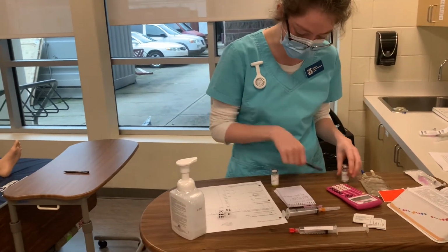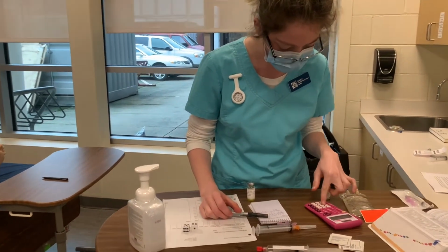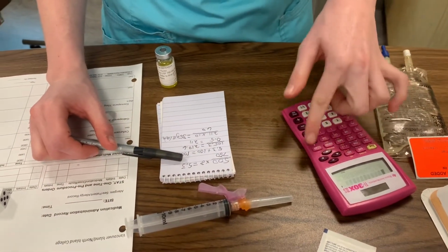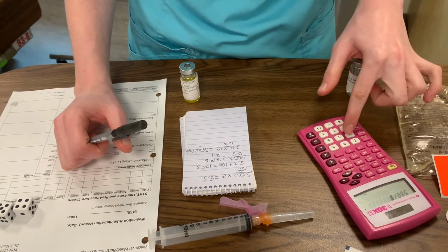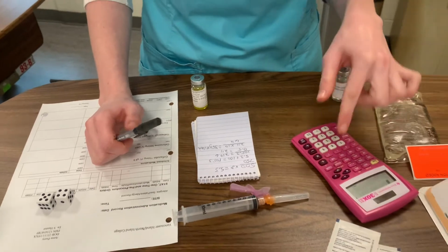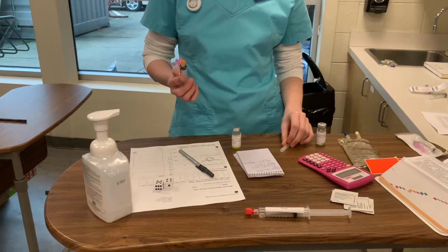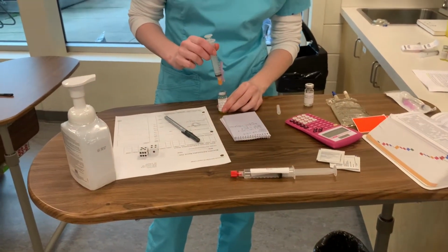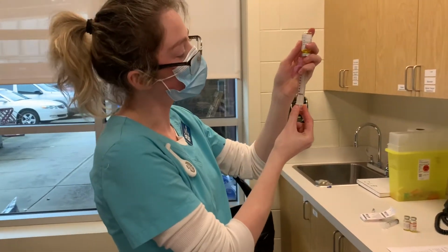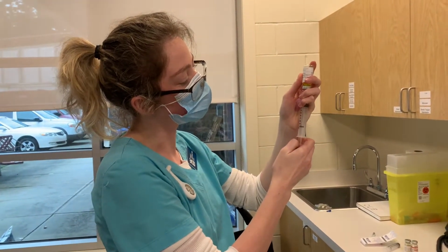And I double check my math. 500 over 750 times 8 is 5.3. All right. Perfect. Now that it's all dry, I remove the cap. Inject that. Invert and carefully withdraw 5.3 mils.